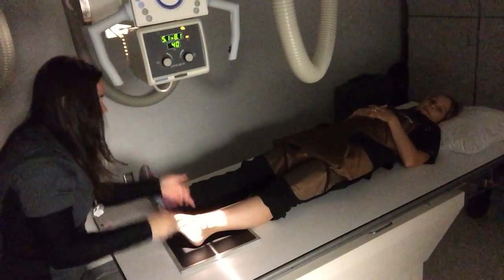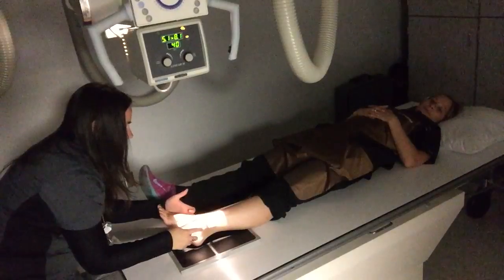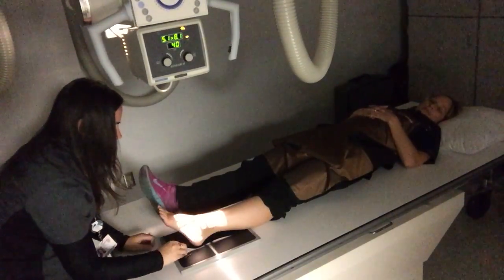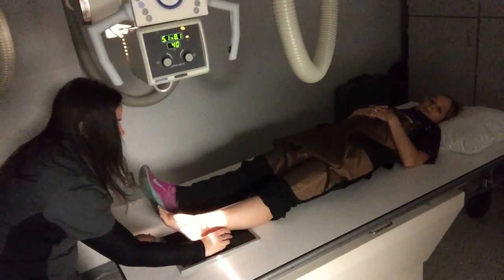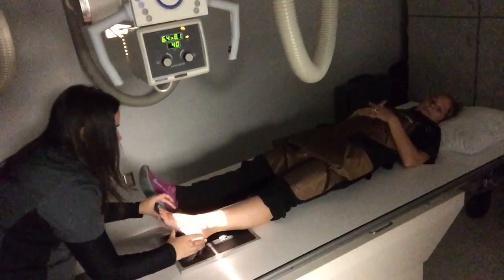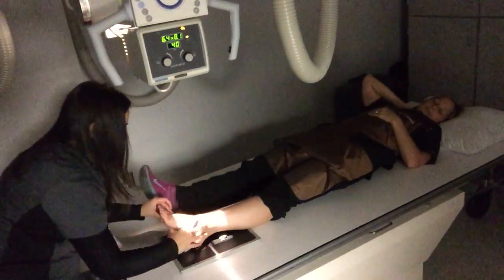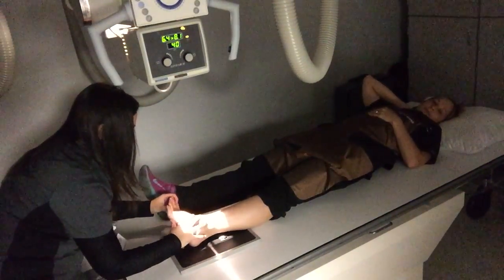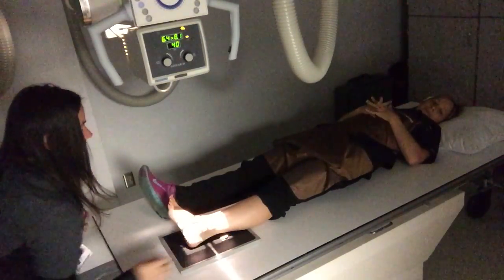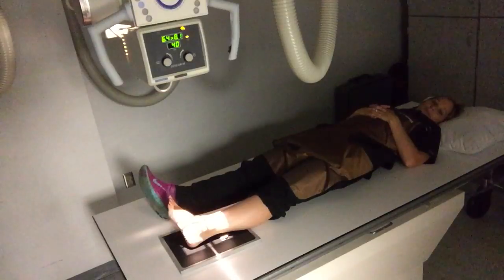And now I'm still looking at that medial malleolus and lateral, and I'm trying to go right in the dead center of her ankle here. Still marking on the lateral side. I'm going to have you pull your toes back again so I can get a good look here. There we go. All right. This is the same technique, 70 kVp. We're going to expose there.